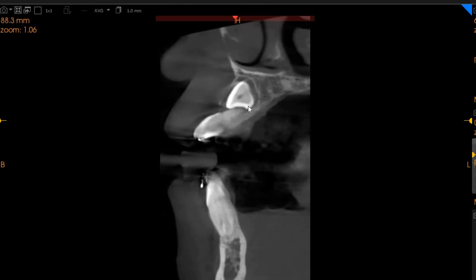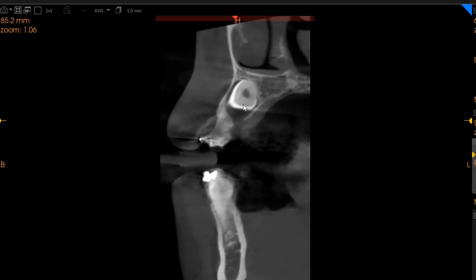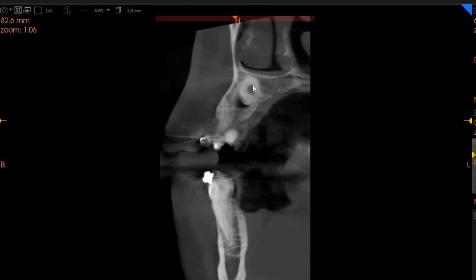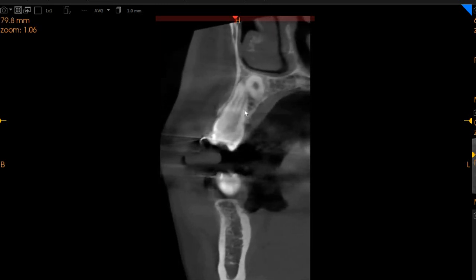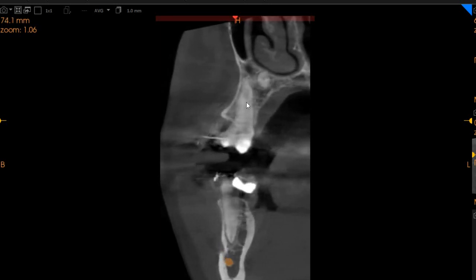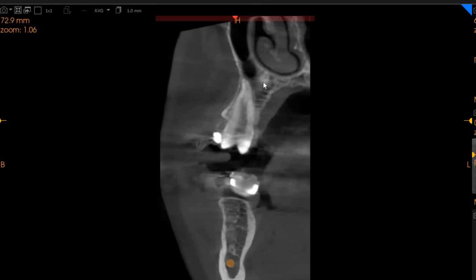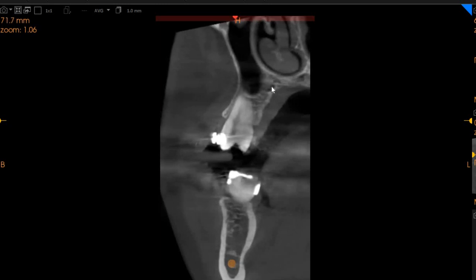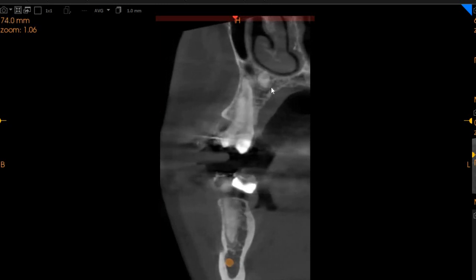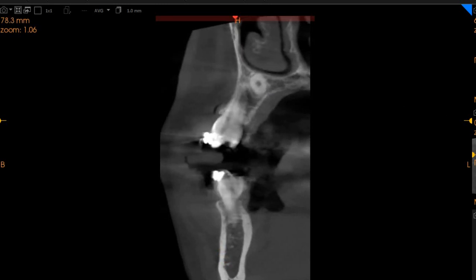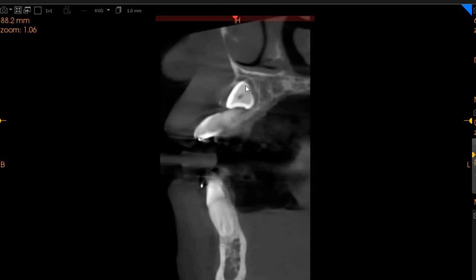The apex is completely closed. This is the canine — this is the crown of the canine. As we are moving distally, this is the deciduous canine, and this is the body of the canine. This is the first premolar, and now this is the second premolar. Right next to the apex of the second premolar, you can very clearly see that this is where the canine apex closes completely and the sinus starts. So the roots of the canine are placed palatally to the premolars, whereas the body and crown of the canine are placed more superficially and buccally.